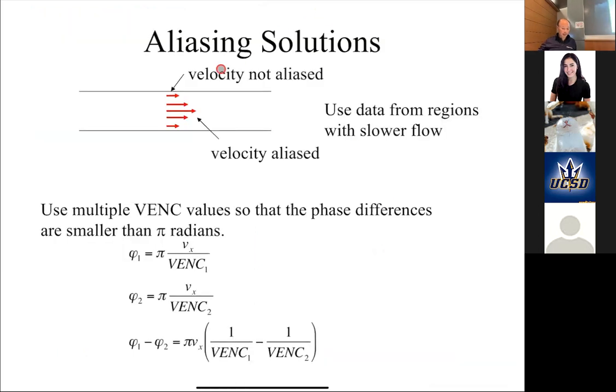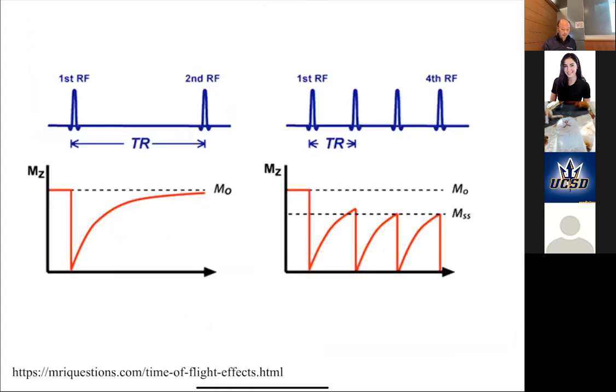So the idea is that it's not totally trivial, because even in one vessel, you can have, oh, this is what we're seeing, especially with laminar flow, right? As you know, the velocity at the borders of the vessel is slower than at the center. And so you can have the center going the wrong way if your Venc is set too low. Okay, so that's phase contrast angiography.